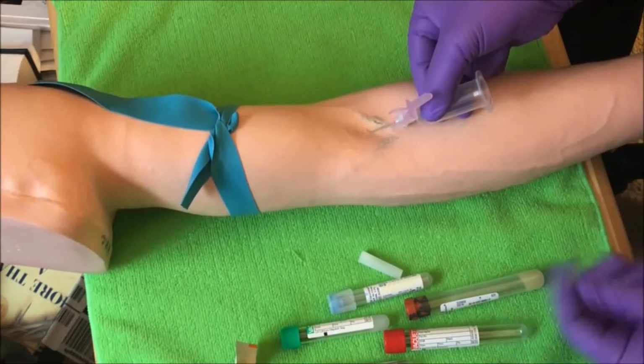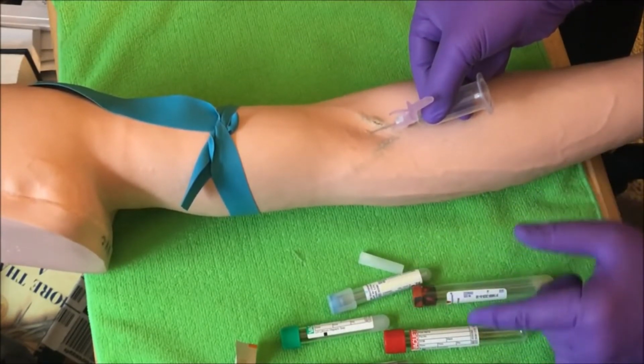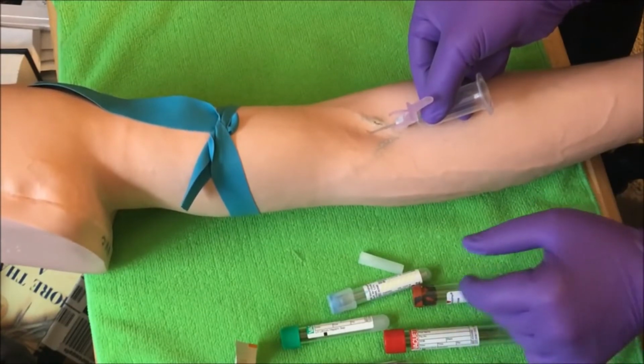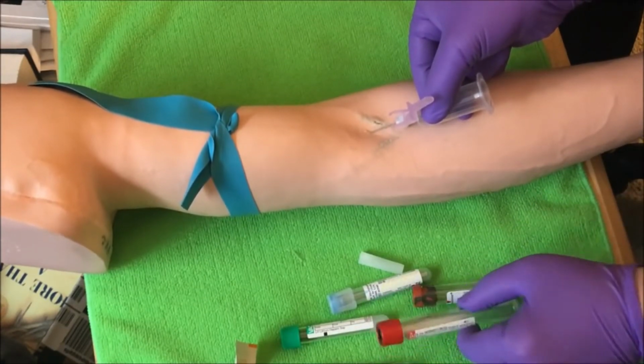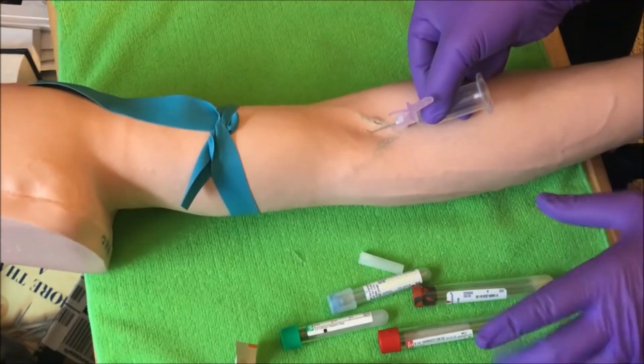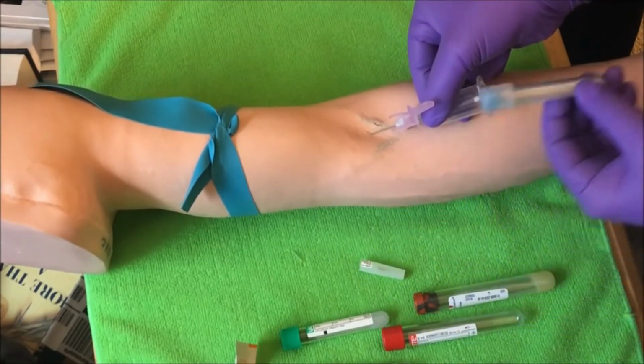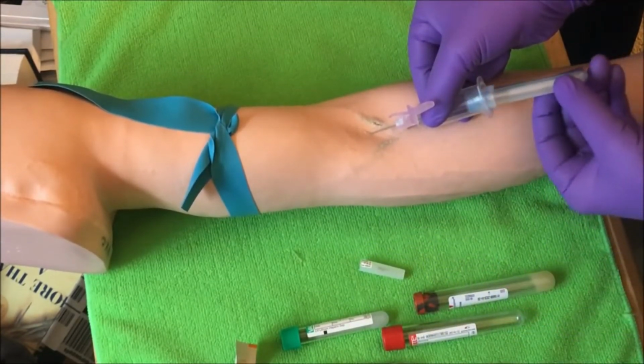Now, if you look at the order of draw, of course, you can go light blue, red, of course, SST, green, and lavender. Standard order of draw. I'll show you where the red top can precede the blue on a butterfly draw to get the air out of the tube on another video. But again, I take my light blue, I put it in label up.